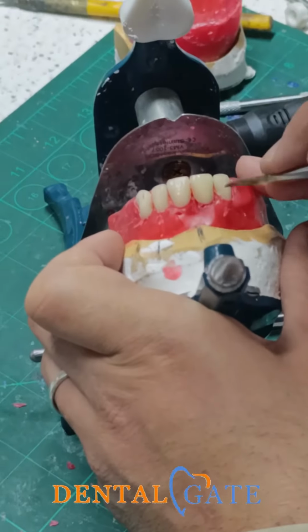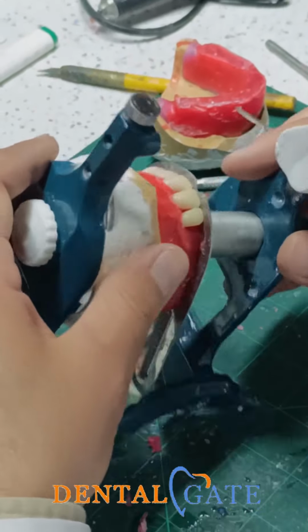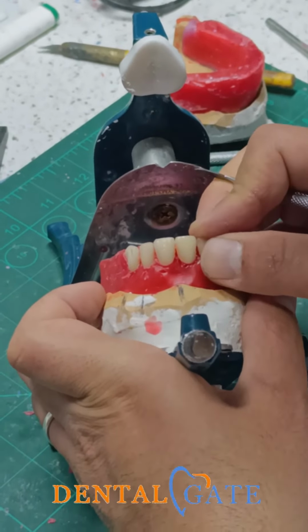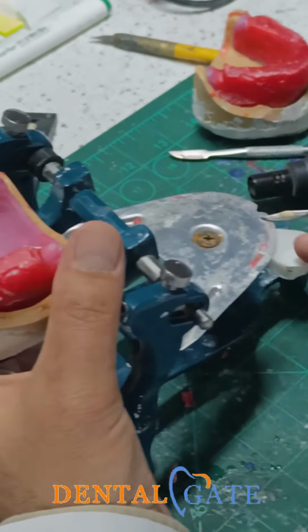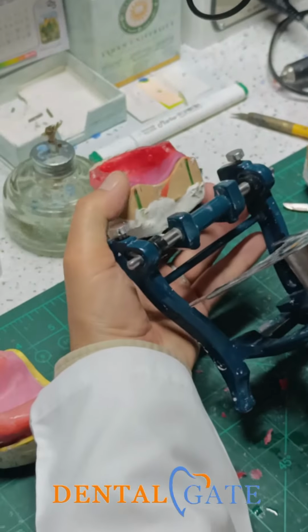And make it complete to all the criteria of the lateral incisor. And in the previous lab I mentioned that we just have the midline and the curve to be maintained. So sometimes this table is not good. Be sure the table is parallel.